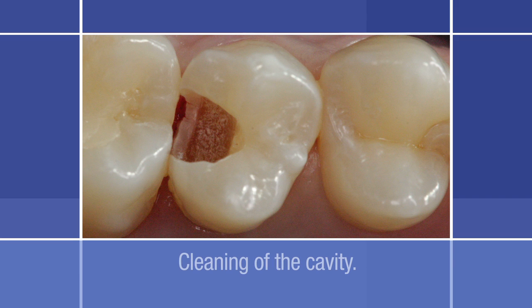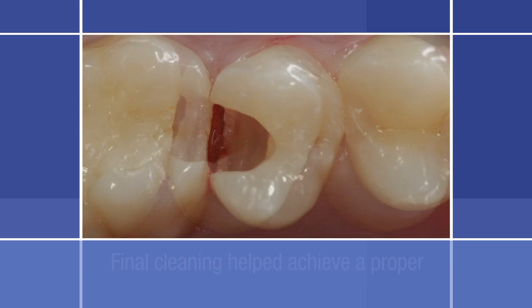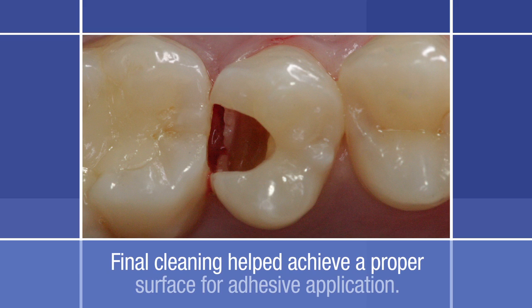Cleaning of the cavity was finished manually with an excavator. The quality of the tissue was also checked. Humid air abrasion was used to finish the cavity preparation. Pulverization with aluminum oxide and water was used for the final cleaning. This step helped achieve the proper surface for adhesive application on the dentin and enamel.